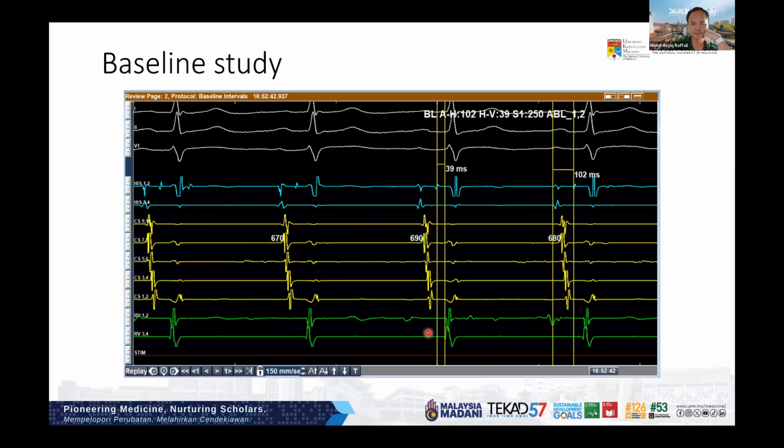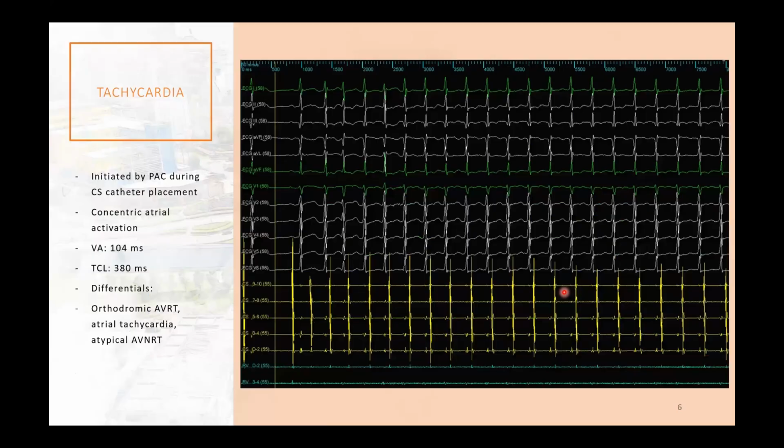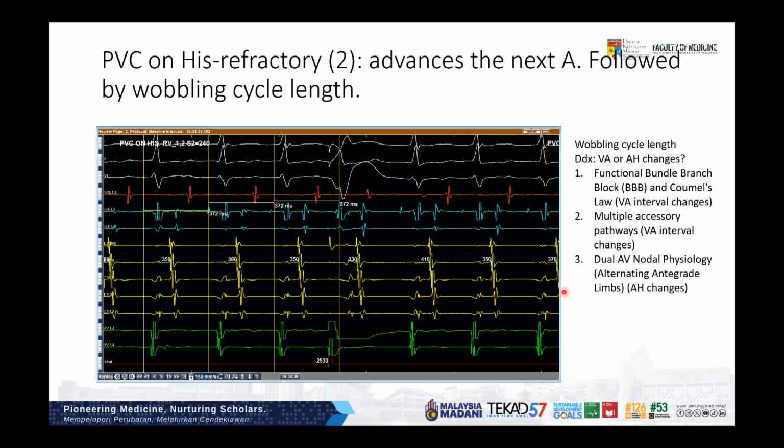Yeah, bring up the V extra. Go to the V extra with the HV intervals. See, you had a single extra right there. So you have a His bundle HH. Did the HH change post pacing, the HV interval? Yeah, it changes. Slightly longer. HV, not AH. Oh, HV. Just before that, HV right after pacing. Yeah, next HV. Yeah, there. Is it longer or shorter? No change. Yep. Right. So that is probably almost against a nodoventricular tachycardia, an accessory pathway.